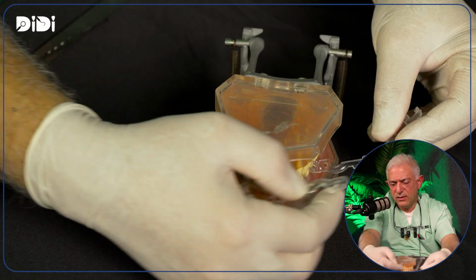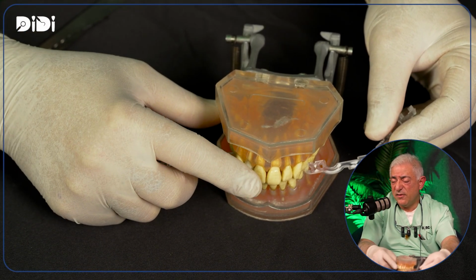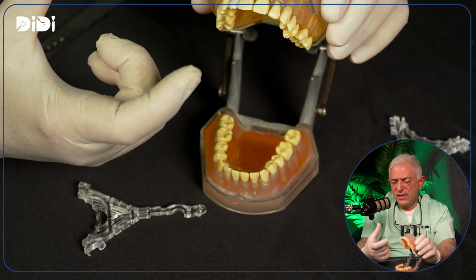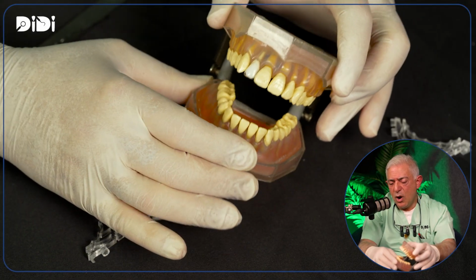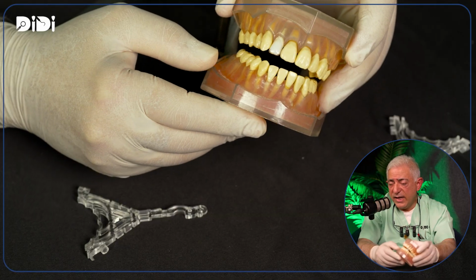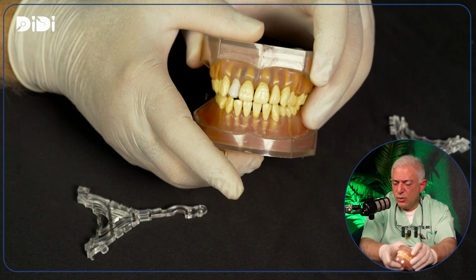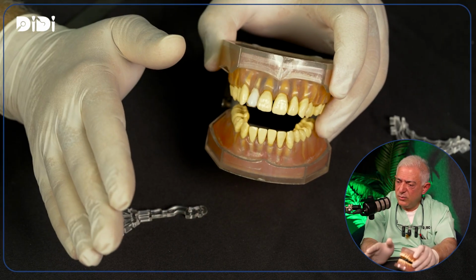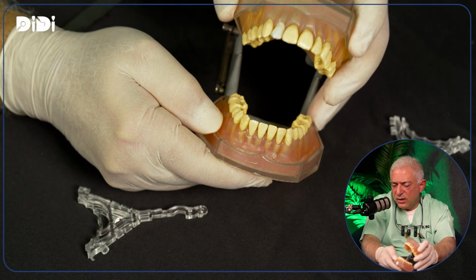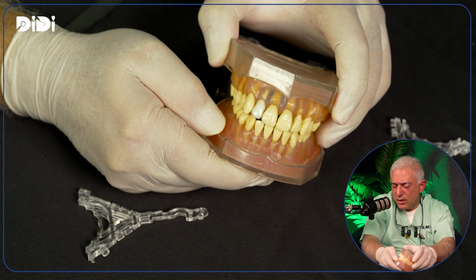And then you inject bite registration material in between. And then that's a physical impression. And then you can scan all the teeth and send the physical bite registration to the lab. They will articulate the jaw 1.5 millimeter in centric occlusion. Why? Because you took it in the mouth with the patient closed. So you do not need a facebow, and the lab doesn't need a facebow. Why? Because you didn't increase the vertical dimension for the lab to close the vertical dimension in the articulator.